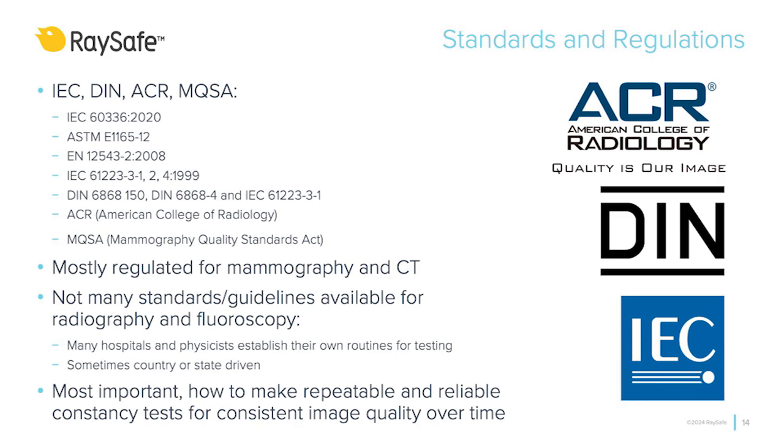While there are established guidelines for mammography and CT, there is a lack of uniform standards for radiography and fluoroscopy. Because of this, many hospitals and medical physicists have to establish their own routines for testing. These routines can sometimes be driven by country or state regulations. The most important aspect is how to develop repeatable and reliable tests. These tests are procedures used to check that the output of a diagnostic imaging system remains constant over time. Consistent image quality is crucial for the accurate diagnosis and monitoring of medical equipment. This emphasis on quality assurance in medical imaging is critical for patient safety and the effectiveness of medical diagnostics.